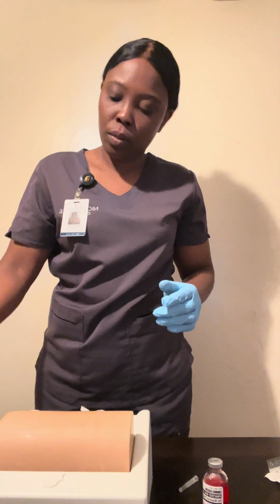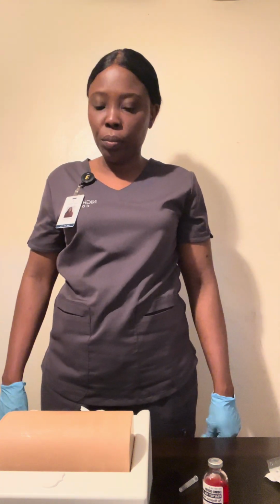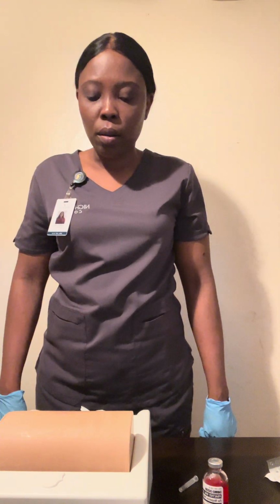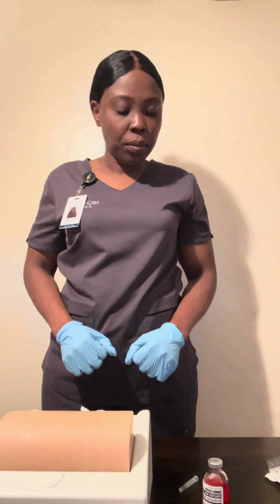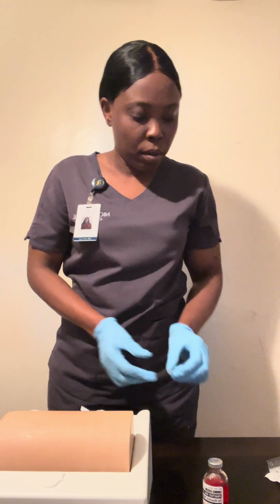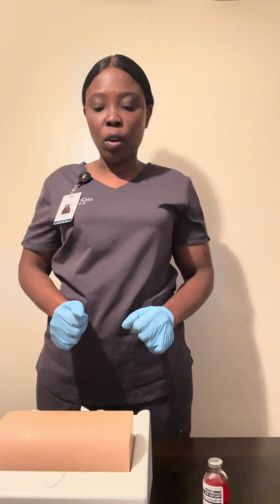And then I'm gonna remove the gauze, clean everything, and discard everything. I'm gonna make sure my patient is in a comfortable position.